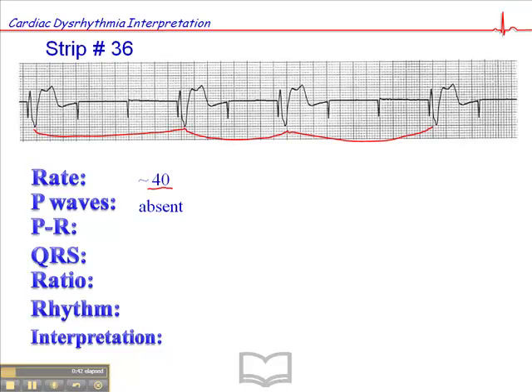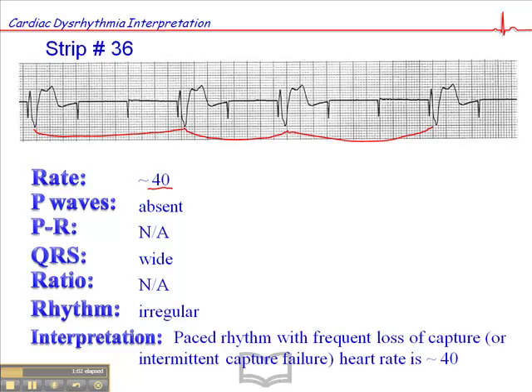We don't have P waves, and this is a single-chamber pacemaker, which is very, very common, where there are no P waves but there's a pacer spike followed by QRS. PR intervals are not applicable in this case. The QRS is always wide in paced rhythms. The ratio is not applicable. The rhythm is irregular. And in this case, we have a paced rhythm with frequent loss of capture, or intermittent capture failure, with a heart rate of 40.